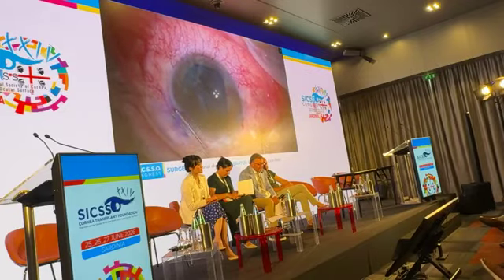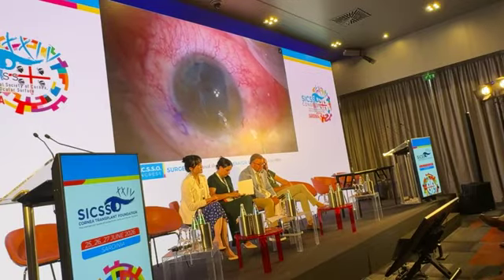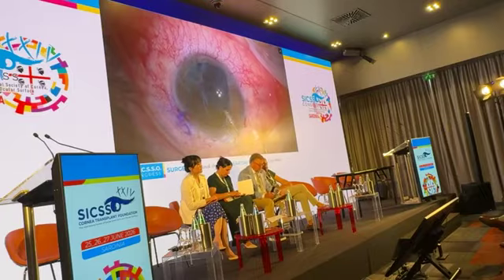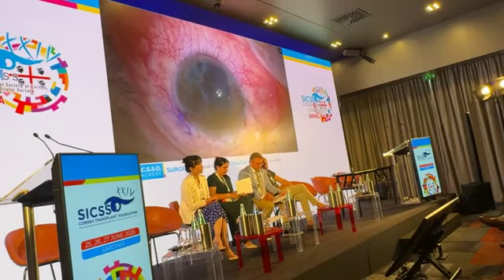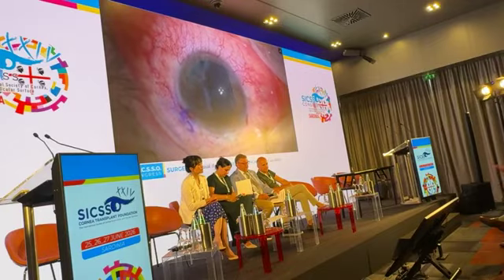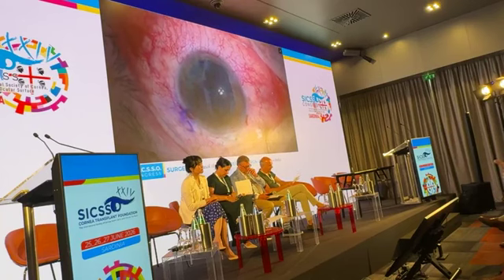It's in the superior part. Yes, here it is. At the level of the main wound, you can see. He's now highlighting the F mark. You can see that the F mark is in the correct position. So I'll use the air. The graft is well centered. Completely centered. So IOCT is not there, no?